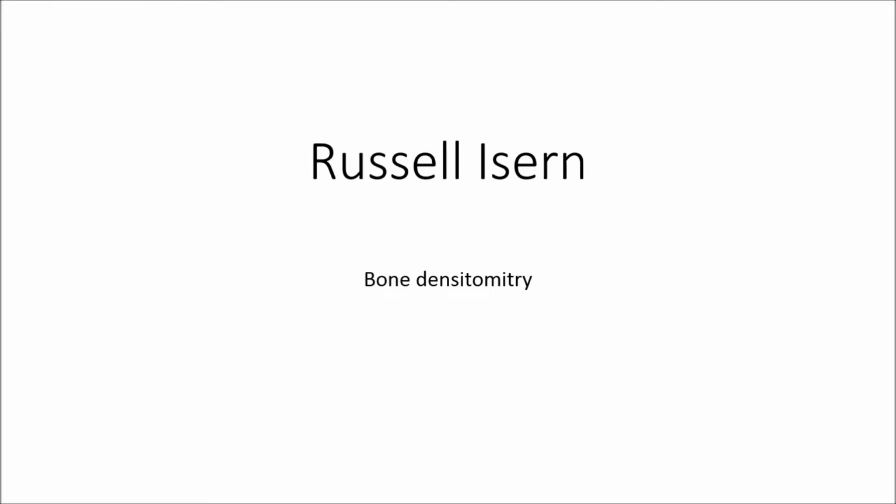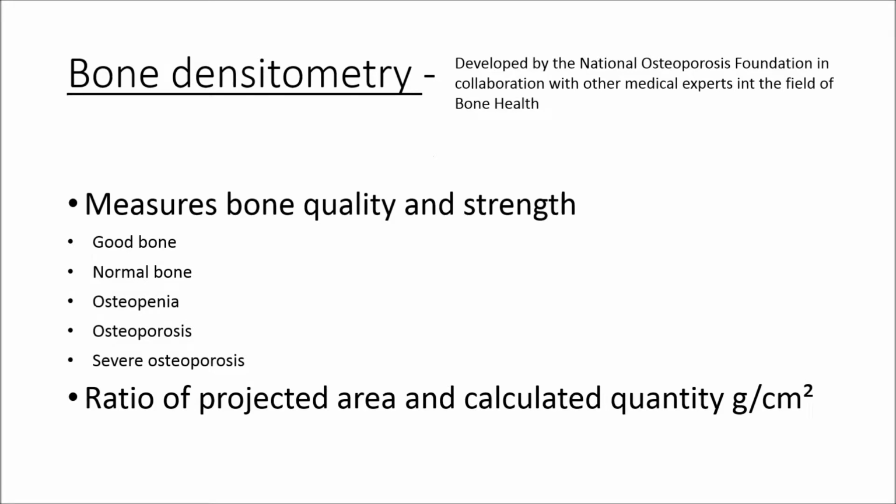Hello, my name is Russell, and in this video I'll be talking about bone densitometry. Bone densitometry is a specialty examination that measures the quality of bone.